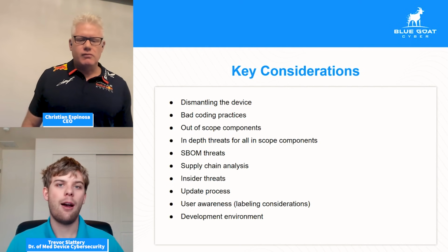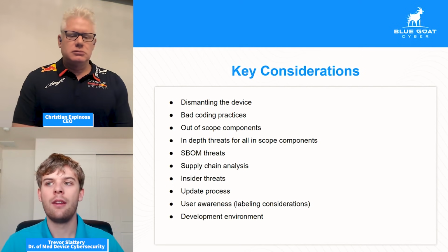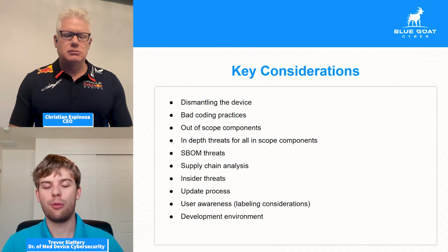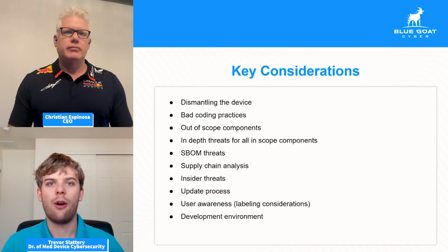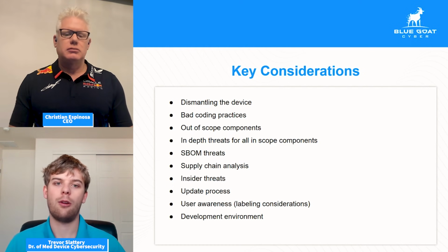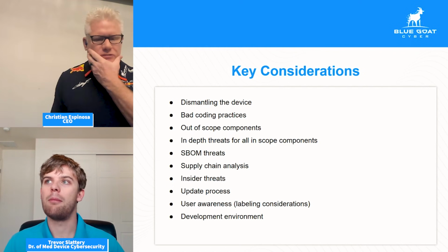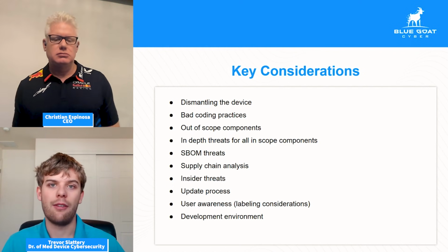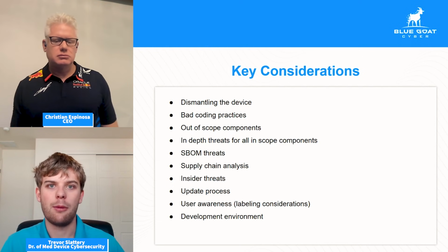If you're doing over-the-air updates, you're going to connect into a network. You can potentially be on the open internet. If you're on the internet, you're much more likely to have attackers try to attack the device. So it is a bit of a double-edged sword, understanding what can happen by introducing a secure update procedure. You can still introduce some risk in and of itself.